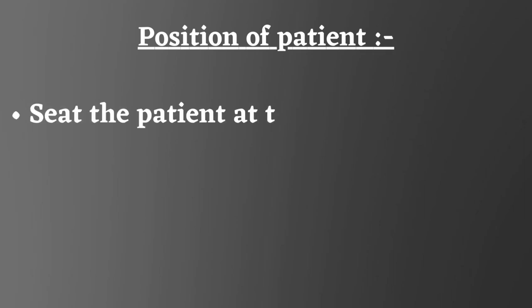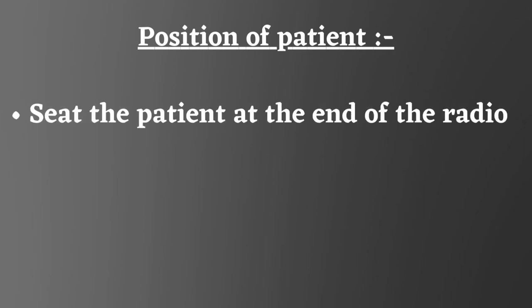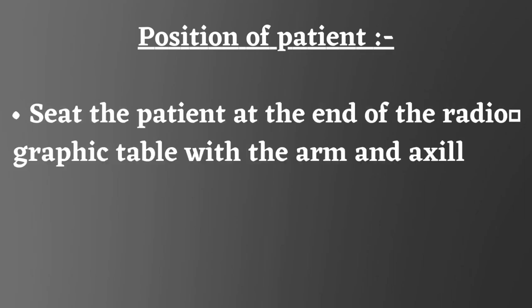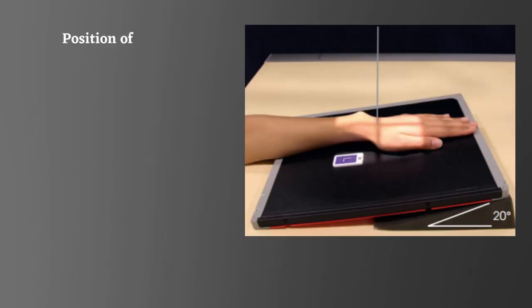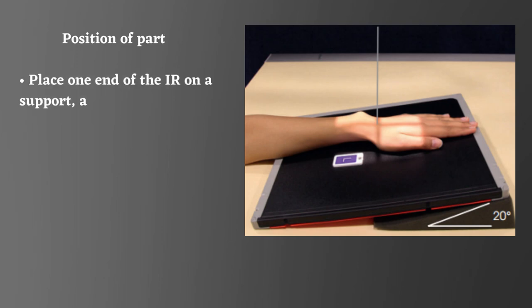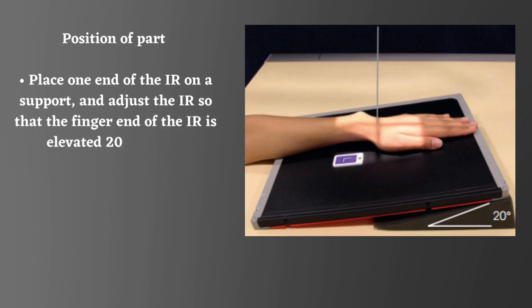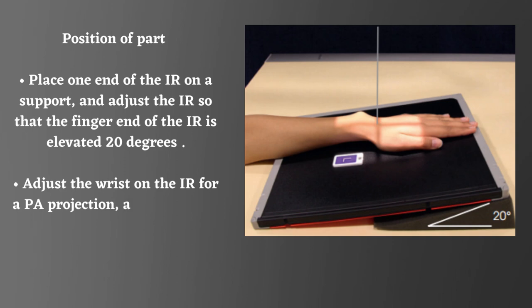Seat the patient at the end of the radiographic table with the arm and axilla in contact with the table. Rest the forearm on the table. Place one end of the IR on a support and adjust the IR so that the finger end of the IR is elevated 20 degrees. Adjust the wrist on the IR for a PA projection and center the wrist to the IR.